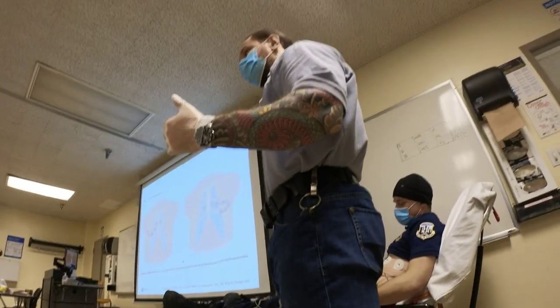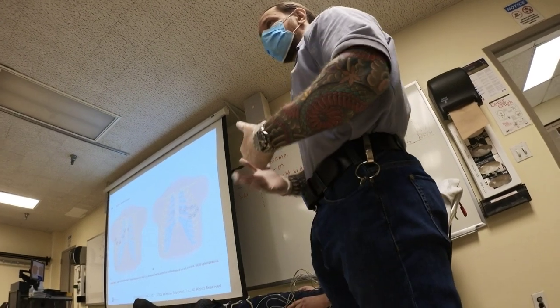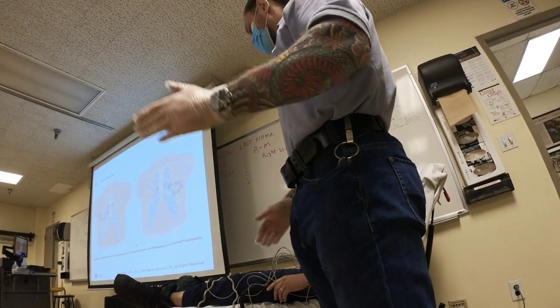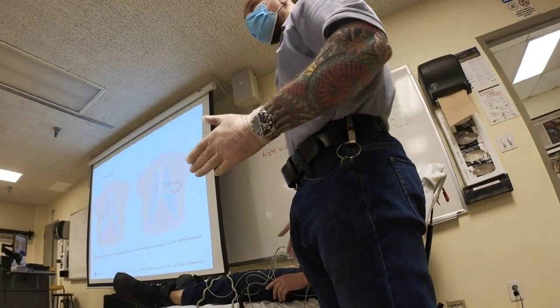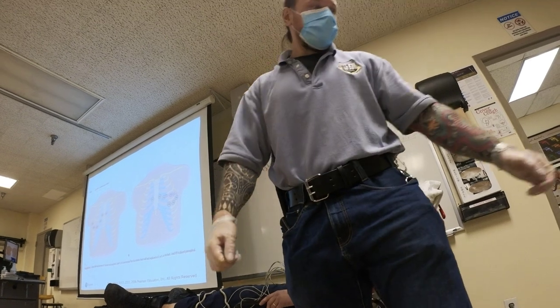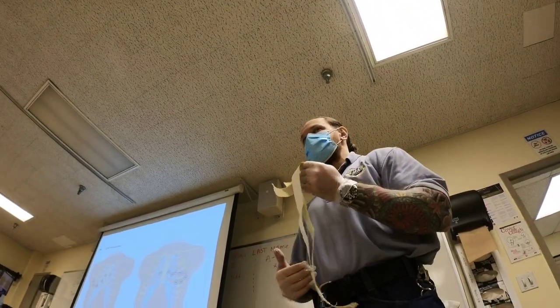Definitely, what you want to do is you arrive on the scene, you run another 12 lead when the ambulance is parked. You got the 12 lead, then you walk into the ER. Hopefully, your patient's on the stretcher with the monitor attached. So you come in, you give your report, you give your 12 leads. If you were going to go straight to the cath lab, you should at least create a concise report.